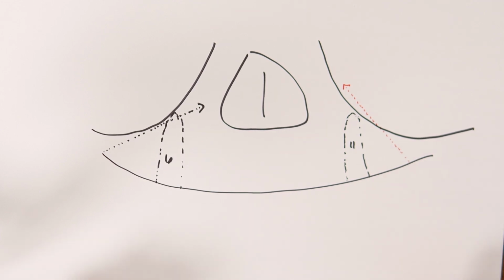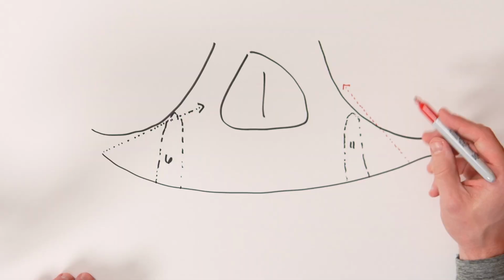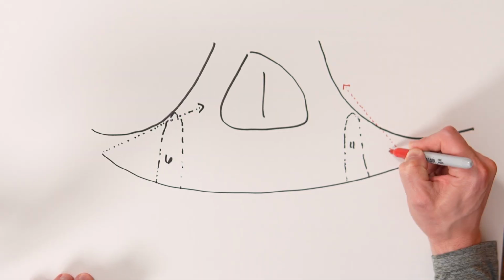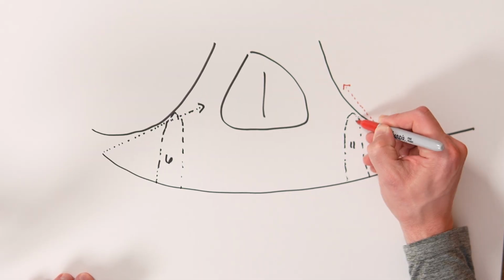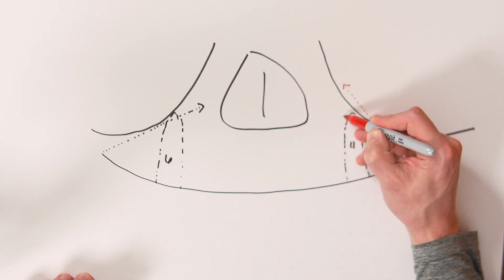You're likely going to be in the sinus, okay? The correction then, if you do feel that you drop into the sinus or you don't see your drill, instead of just saying, now I don't know what to do, I'm uncertain where I am, just redirect your drill until you see it pop through the apex of that socket. You'll see this come through when you look in the socket, and now you know where you are.